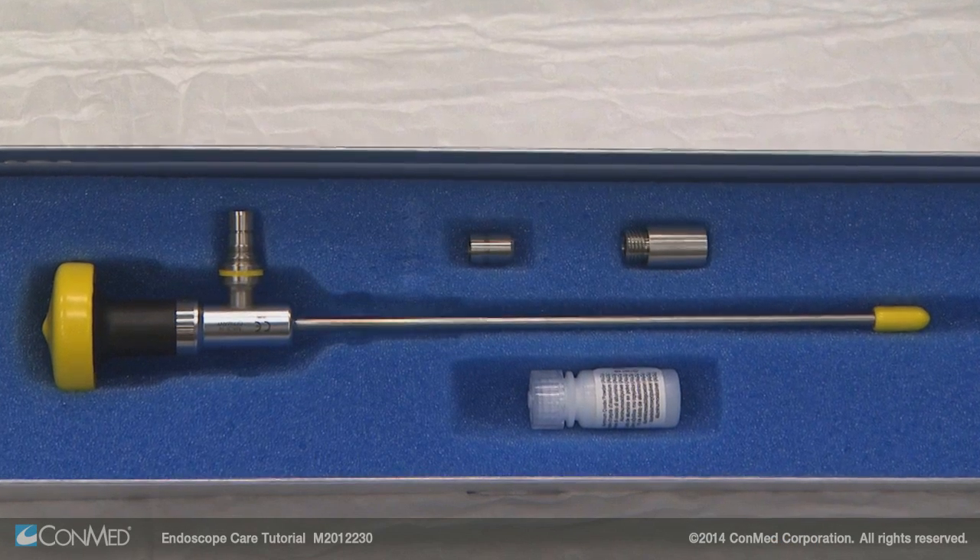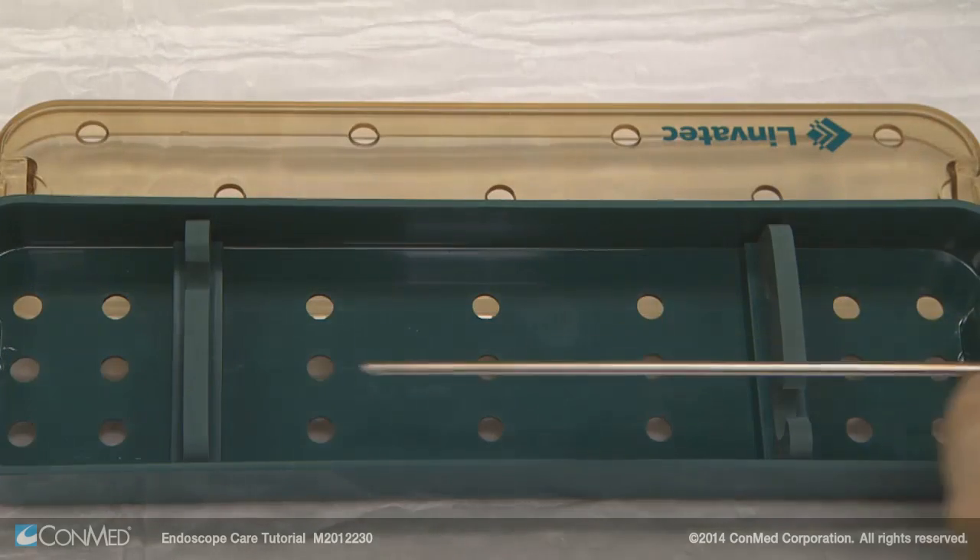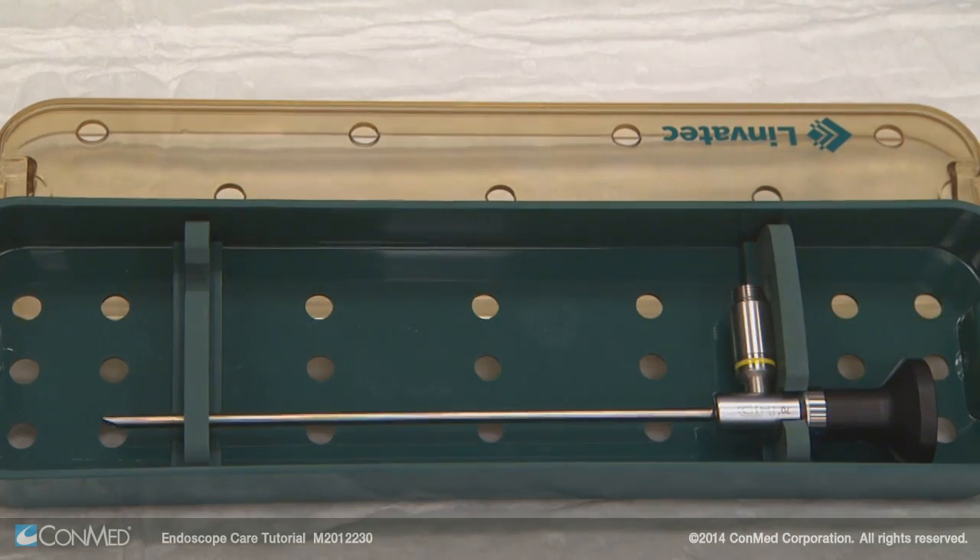When not in use, the endoscope should be stored in either its original shipping box or in a ConMed Linvotec instrument storage tray to prevent damage.